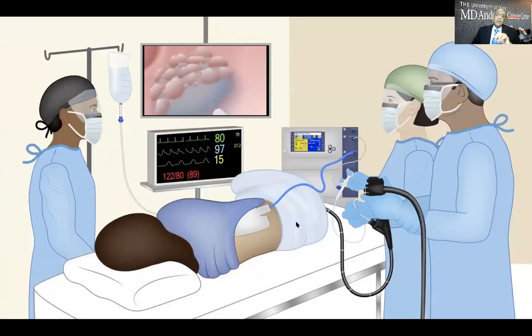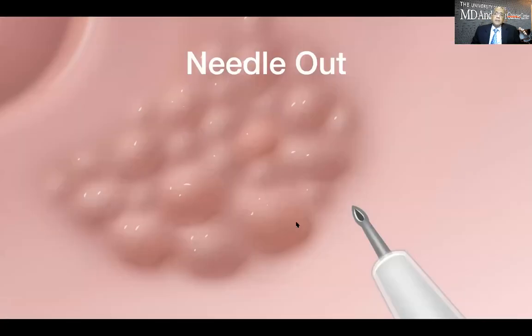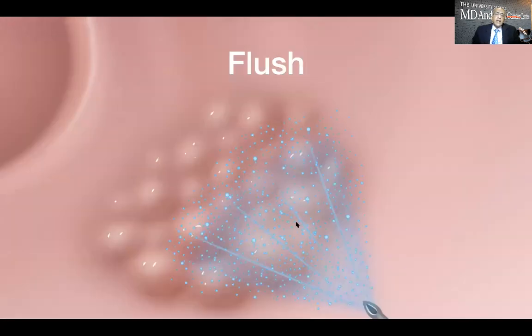So now let us talk about how do you find the submucosal plane and create a beautiful injection so that you could lift the lesion the way you want using a technique called dynamic submucosal injection. So first step, ask your assistant to pull the needle out. Then make sure that he flushes so that you are not accidentally injecting air, because the needle has not been primed.